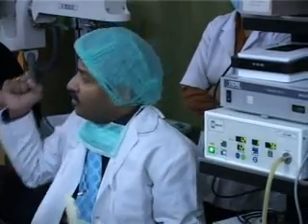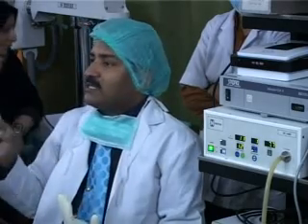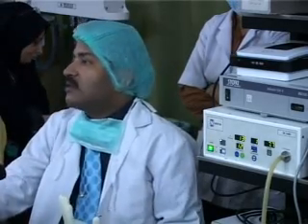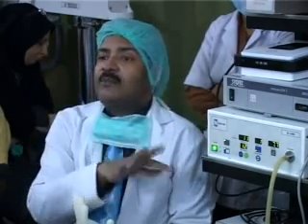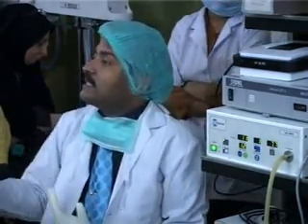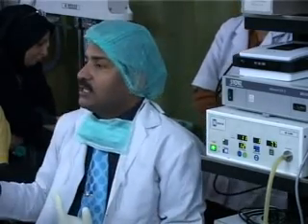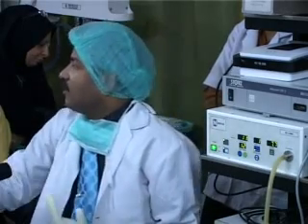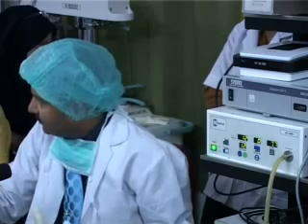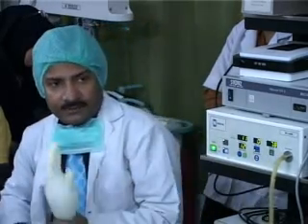Why? Because in that mode the flow rate should never be more than 1 liter per minute. Otherwise, if the gas is going into a vessel, there may be a chance of air embolism. But when you are performing surgery, you should have the maximum, because if bleeding has started, if you are suctioning, or if there is any gas leak, in those situations you don't have to worry, the insufflator will take care. It will replace the amount of gas which is lost. So this is known as flow rate. There are two types of flow rate: one is 0 to 1, another is 0 to max.